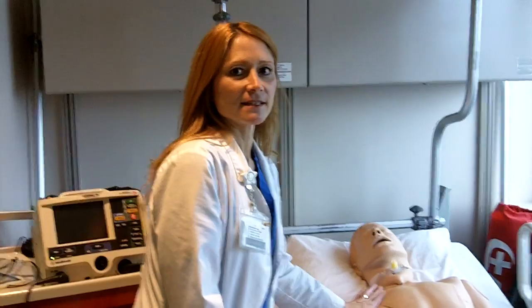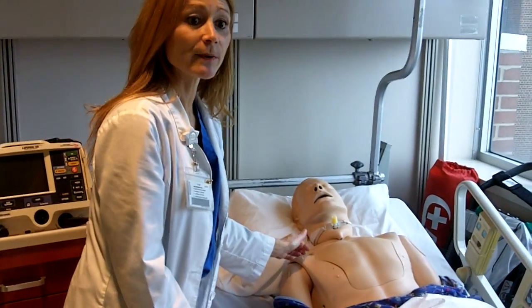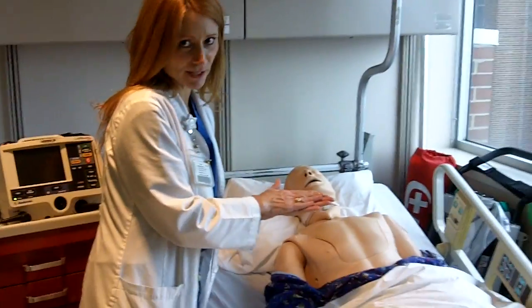First, we want to make sure the patient's skin is clean and dry. If there's excess hair, I will shave the hair off. This way, when I put the pacing pads on, it will make good contact.